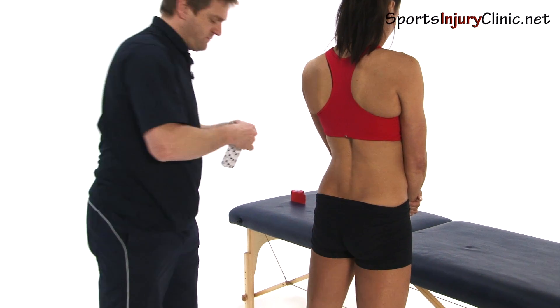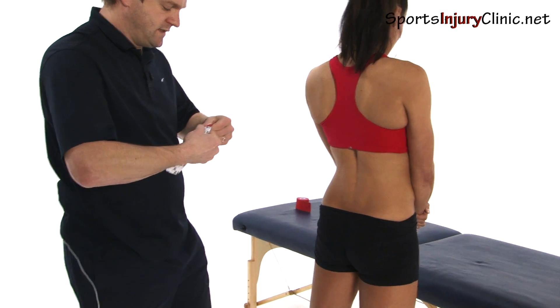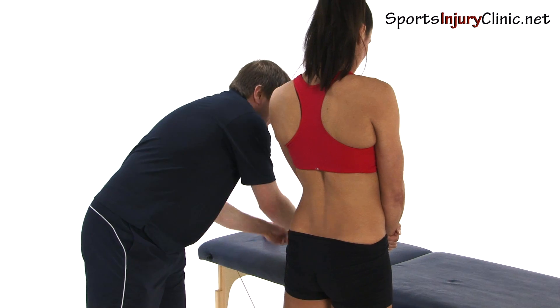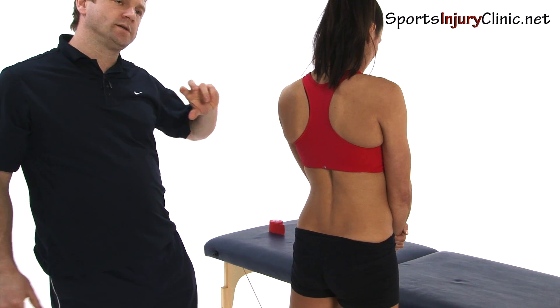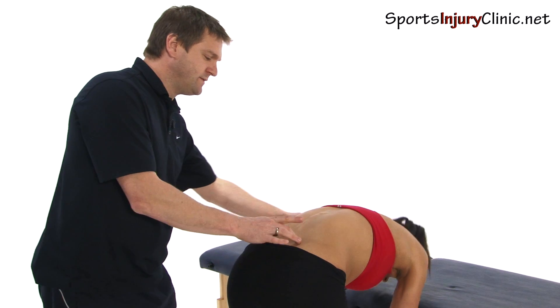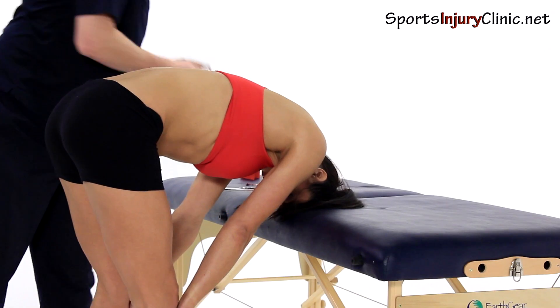That's one. Now I'm going to do it on the second one, like so. That's two. Now we're going to apply the tape. What we need is the muscle in a stretched position, so we're going to ask the patient to bend right forward, so we put the muscles on a stretch.